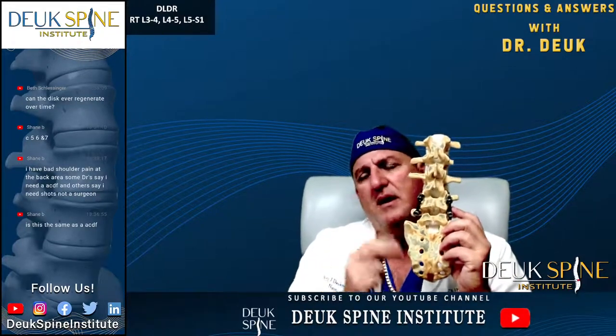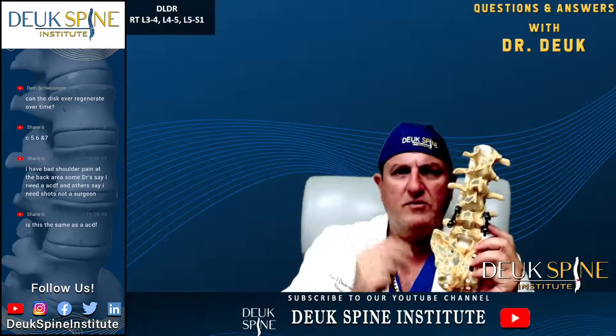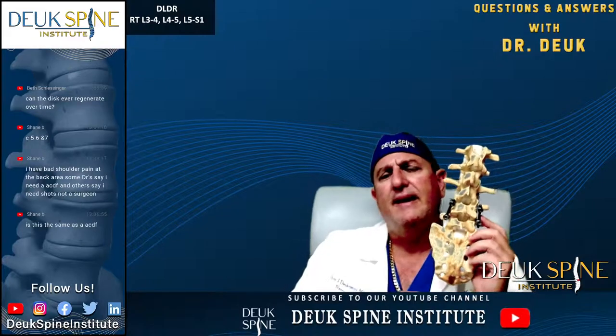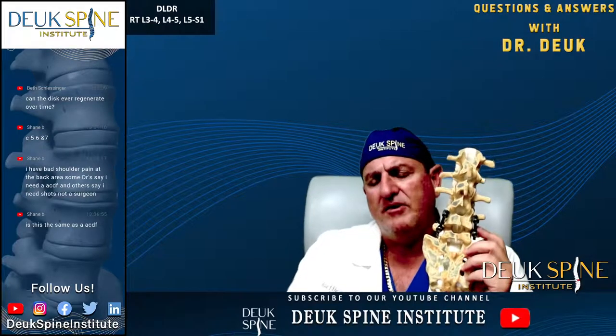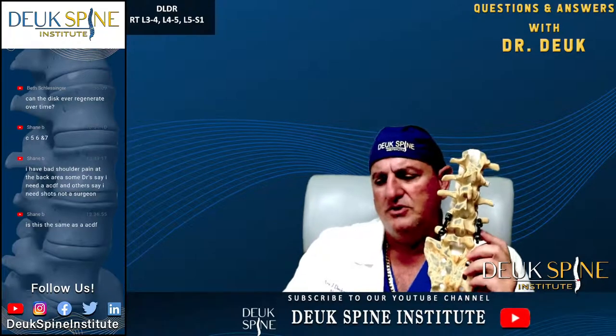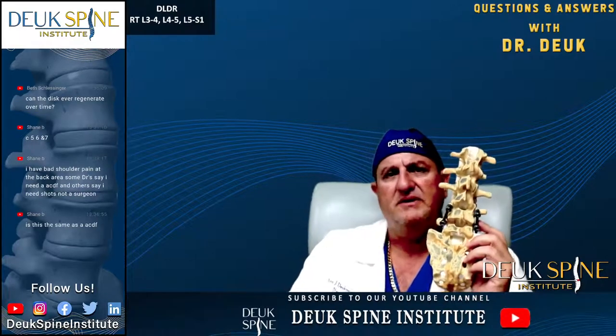I looked at the MRI, I confirmed there were three herniations, small, they were called disc bulges, and it was the annular tear in the disc bulge causing his back pain. So we just got through repairing all three discs.